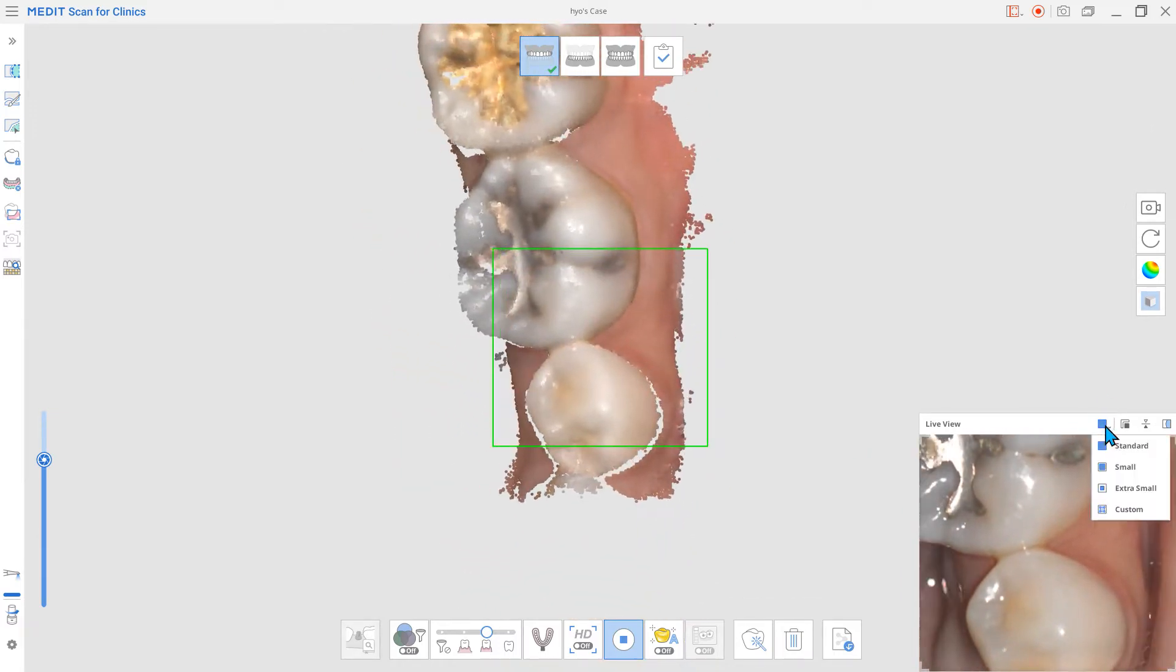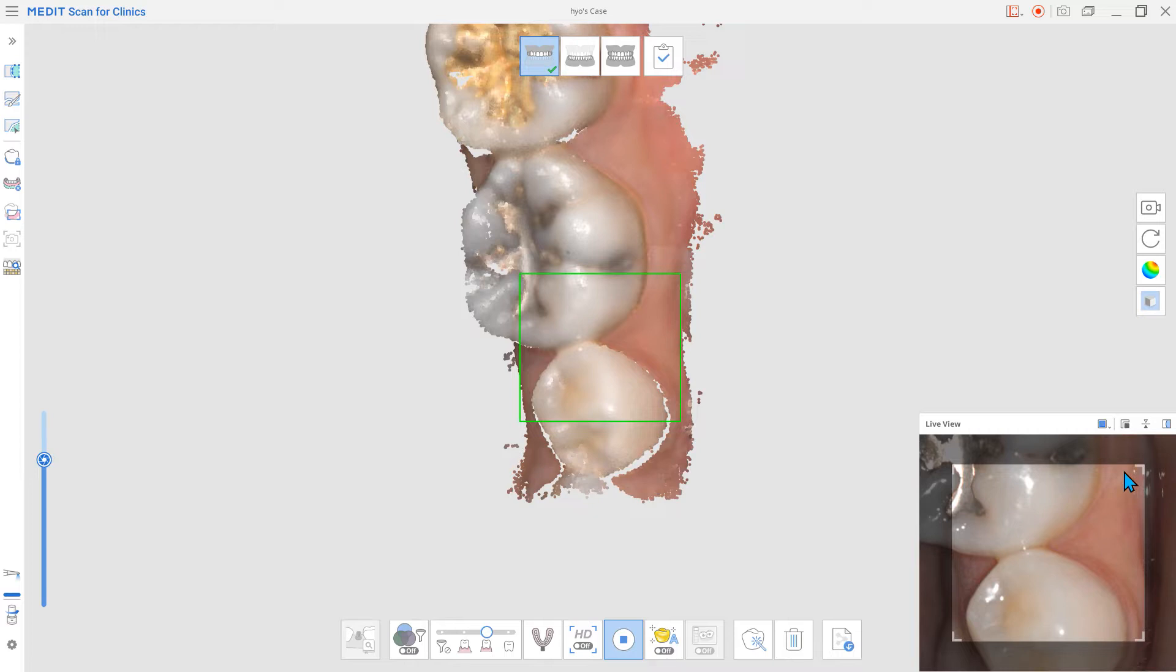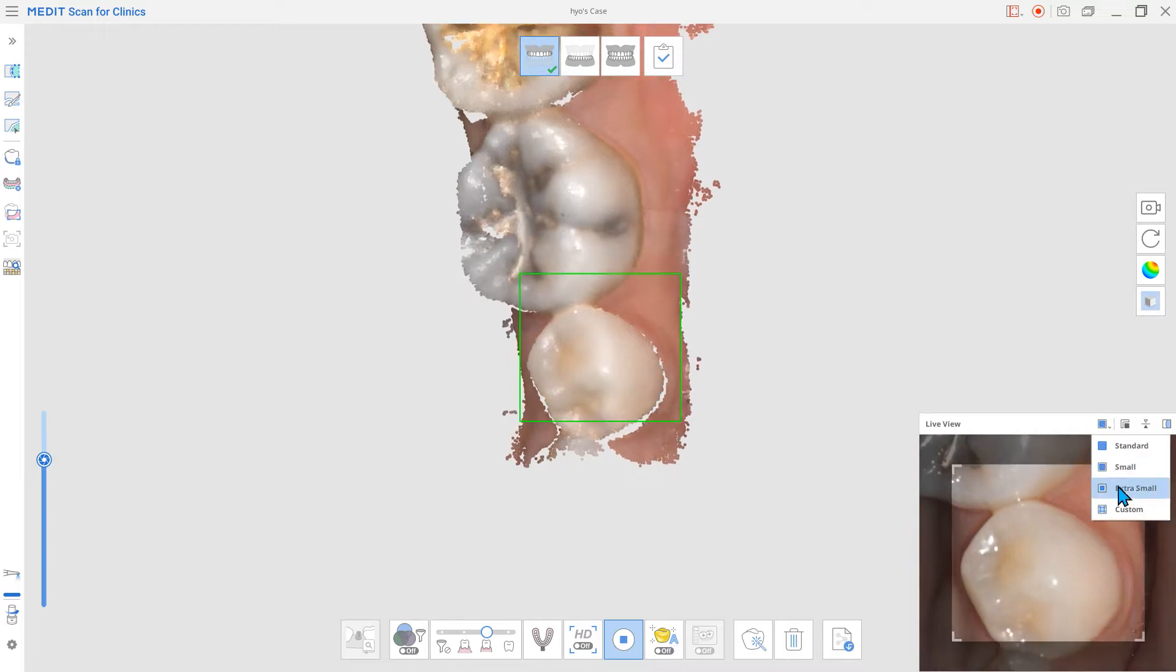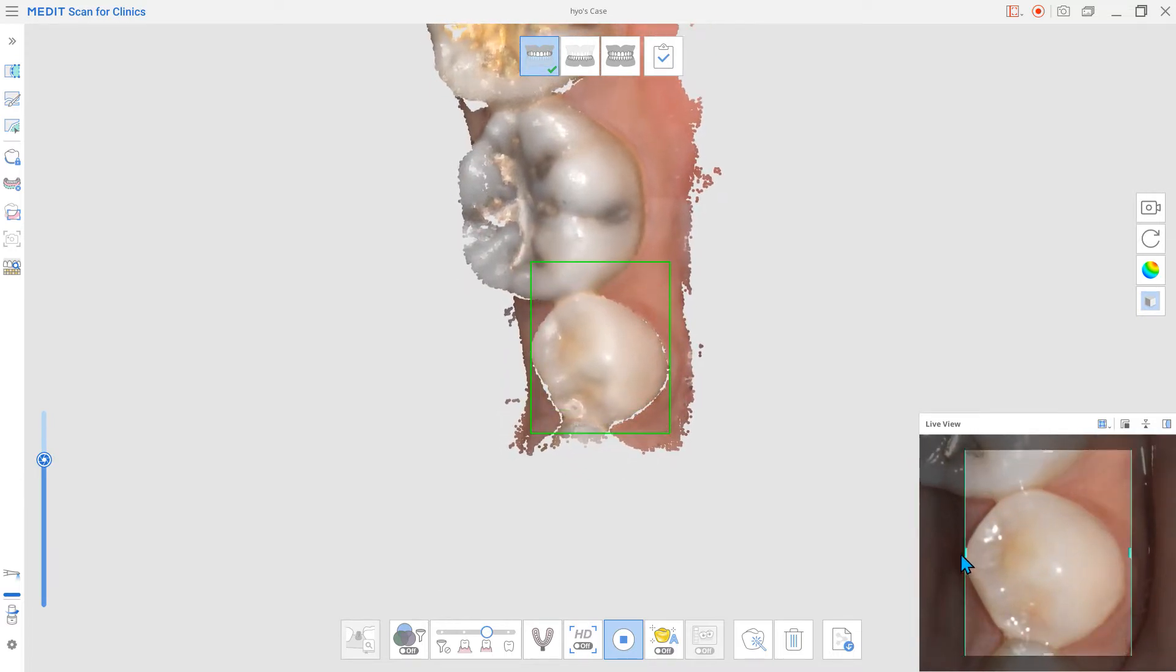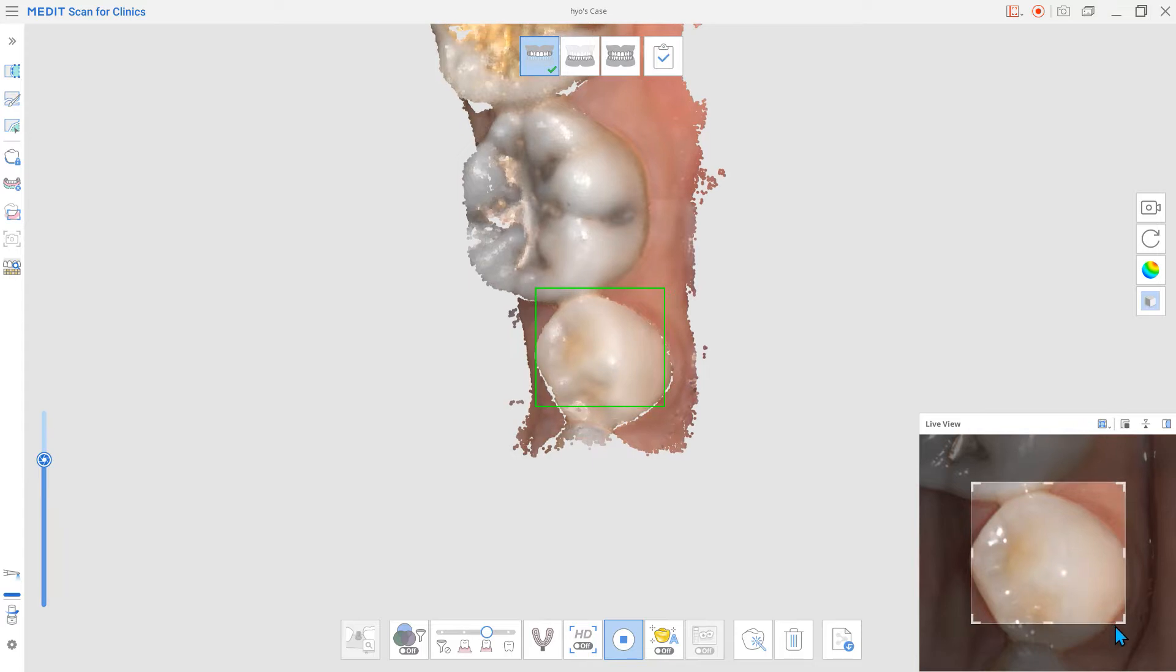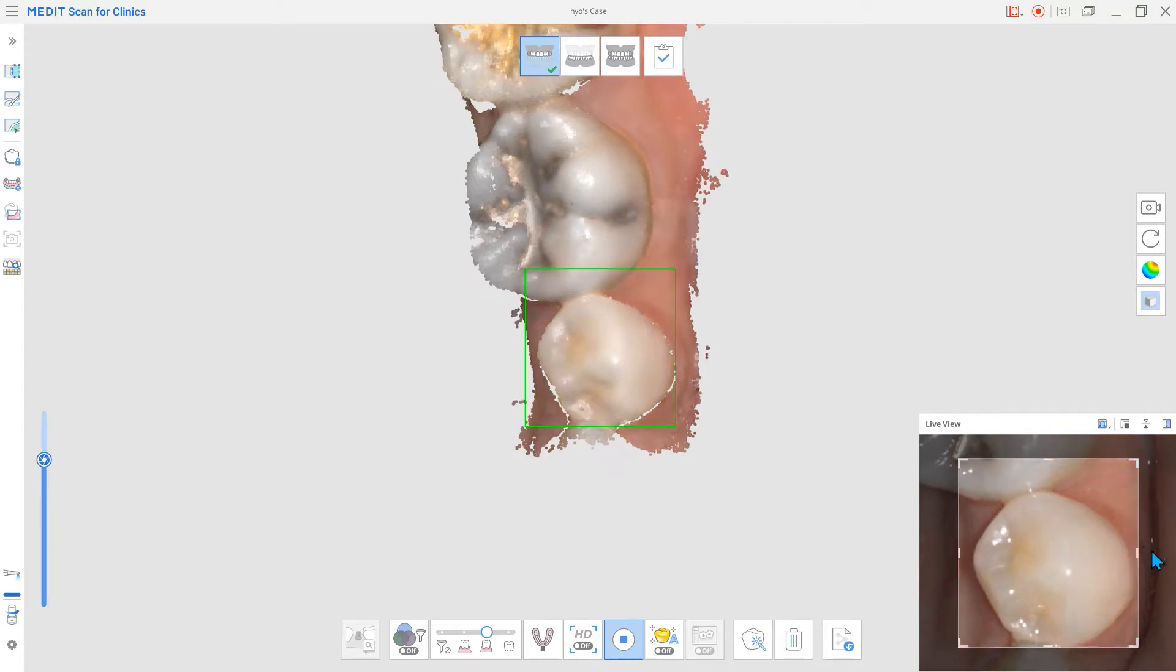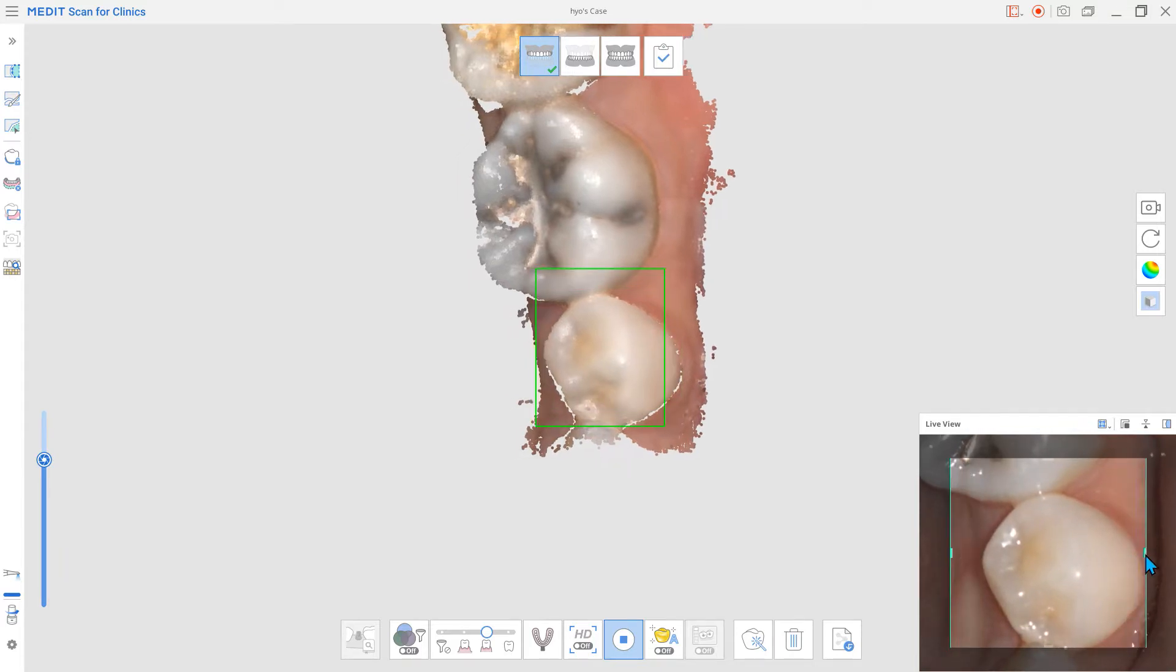You can control how much of the surface is being captured through the remote control mode or in the live view window settings. Adjust the scan area according to your case for a more convenient scan experience.